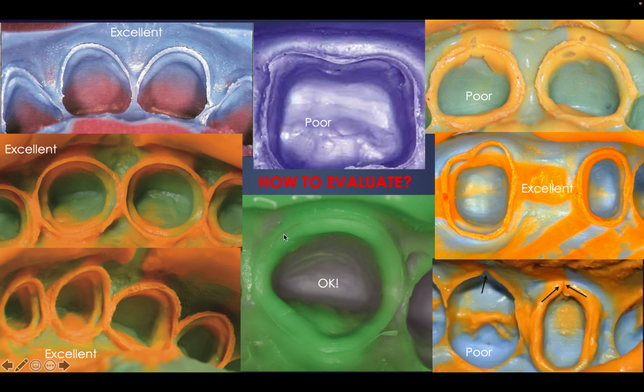This is your margin. If he goes beyond that, he will have a thicker margin, or a thinner margin, where it is a faulty impression or faulty crown, and you might need to redo it. So that's why, although if the technician is clever or experienced, it might be okay, it's not excellent like those where you have reproduced the skirt or the flush or impression of the sulcus.